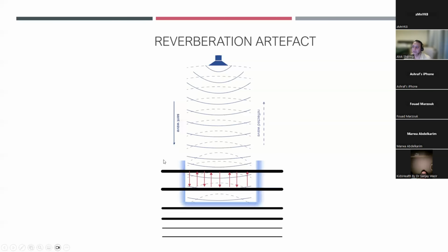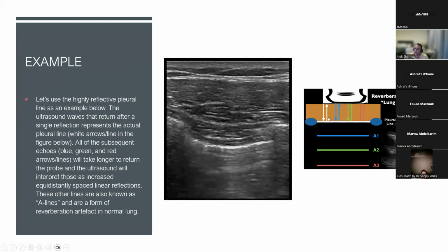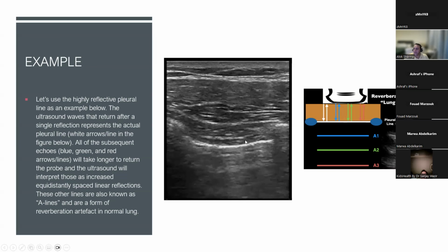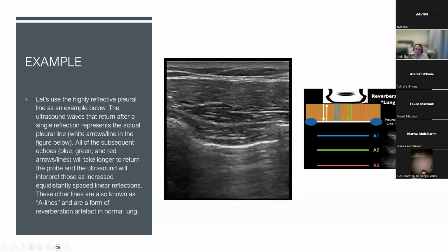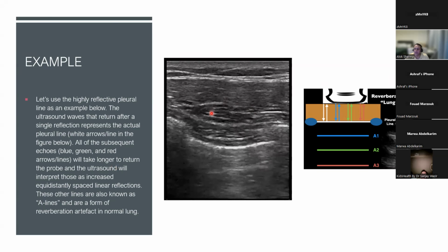Thank you. So again, just an example of what is happening. This is the probe, this is the transducer. Sound waves come through, reflecting back from the pleural surface. Naturally, because of the difference in acoustic impedance between the soft tissue and the pleura, the reflective surface of the pleura is bright. But really, what is happening is this pleura is naturally shaken by the sound waves. It's creating reverberation artifact. As you go down, this reverberation artifact becomes less and less. It's a little bit brighter over there, less bright over here, and it completely disappears. It's similar to that ripple effect you see in the pond.